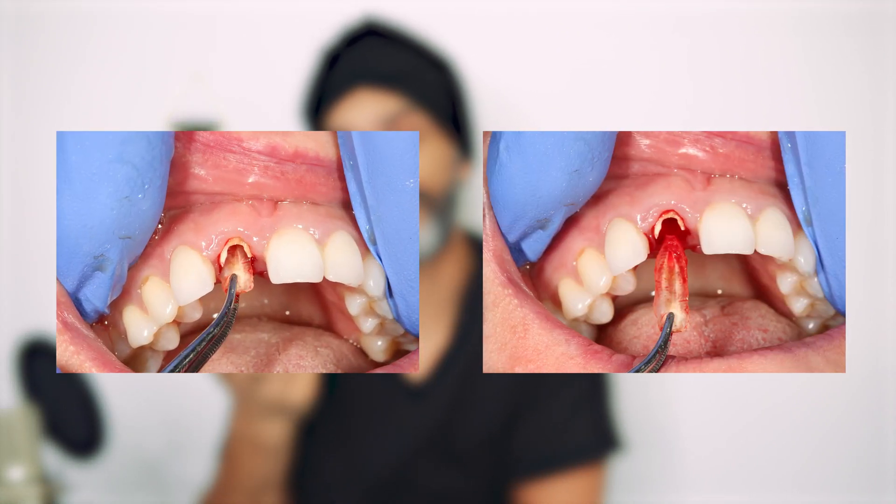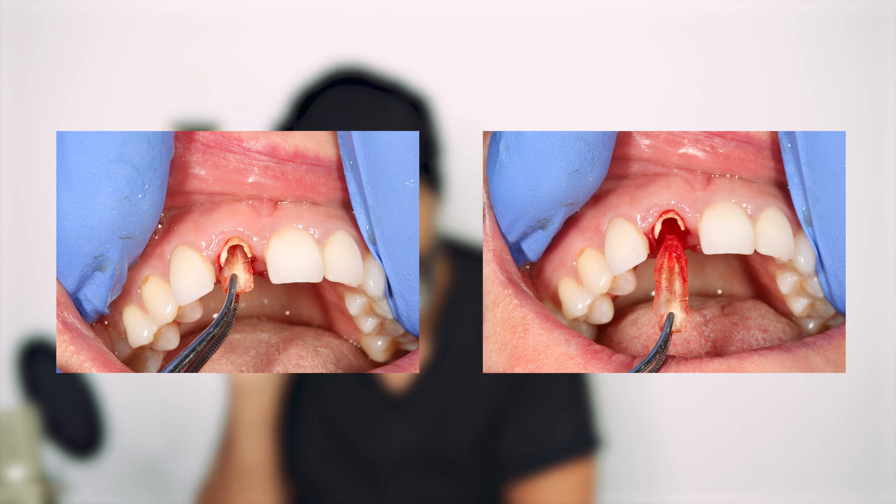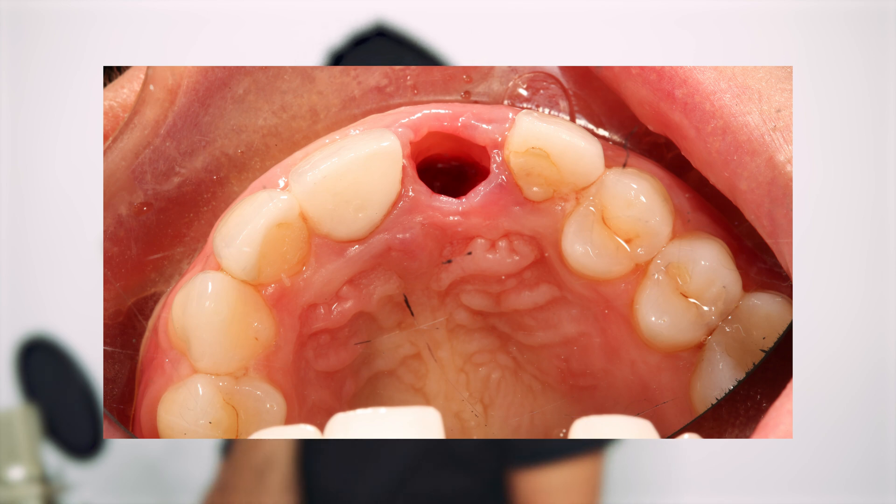So what can we do at the time of taking the tooth out? We could have put an implant in if we didn't have that infection, and that would have saved us a lot of time. The other thing that is potentially possible is to half take out the tooth — this is called the socket shield technique. Essentially what we're doing is leaving a little sliver of tooth. You have to dissect the tooth, cut it in certain places, and only take out the root canal part, just leaving a thin sliver to support the outside surface. This works quite nicely — it's not absolutely perfect, but it does help reduce the amount of bone shrinkage and volume loss that we get.